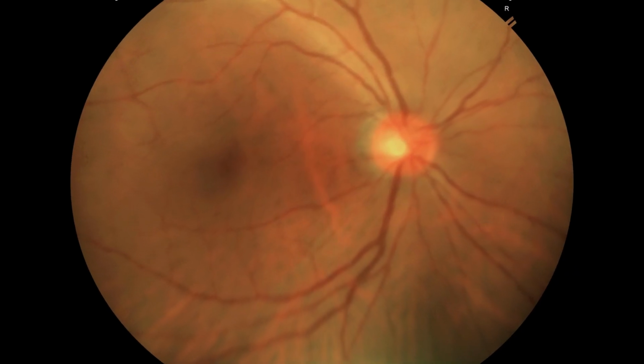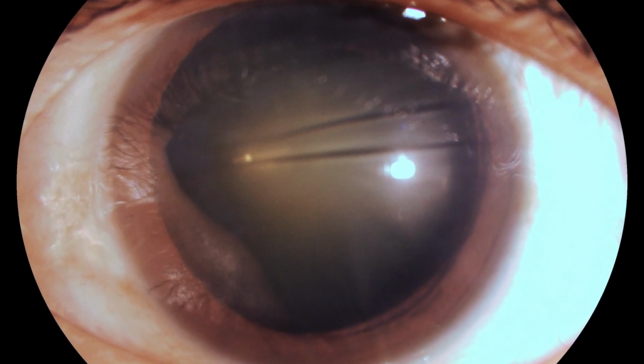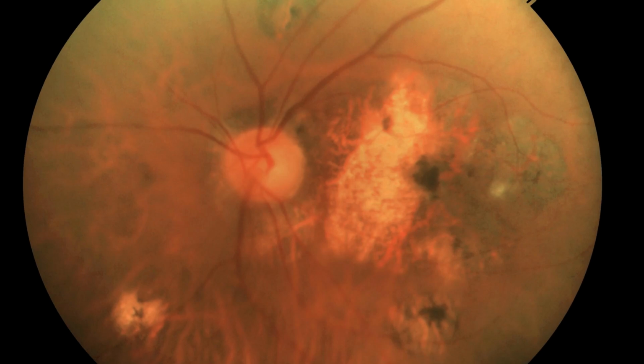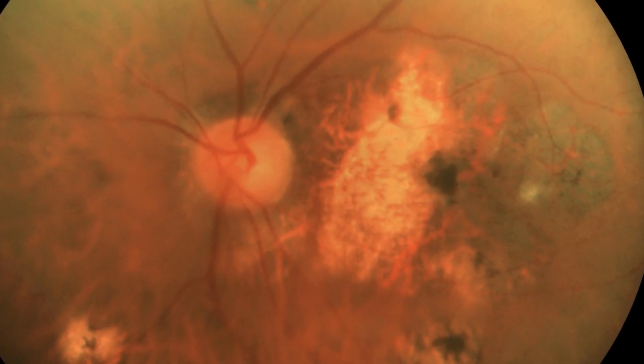This is the right eye fundus, and this is the other eye which had a similar cataract, and this had a worse situation because the fundus was not so good and there was a chorioretinal scarring at the posterior pole. This must have been secondary to myopia.